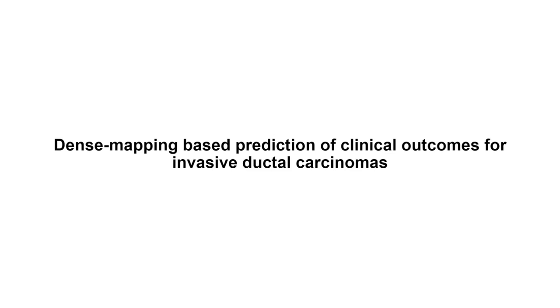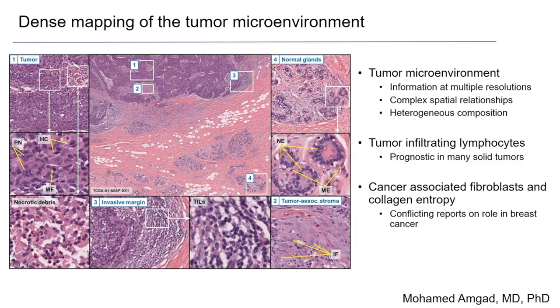So let's talk about these feature engineering approaches first, looking at this breast cancer problem. We have a student who is interested in machine learning, but he's also very interested in breast cancer biology. And so for his entire PhD, he set out to develop algorithms that could describe the tumor microenvironment and all of the components and interactions that you would find in a breast cancer slide, looking at what's happening in stroma, what's happening with the epithelium, and what the immune cells are doing. And so he set about to build this model in a way that would allow him to ask specific questions and investigate these topics.